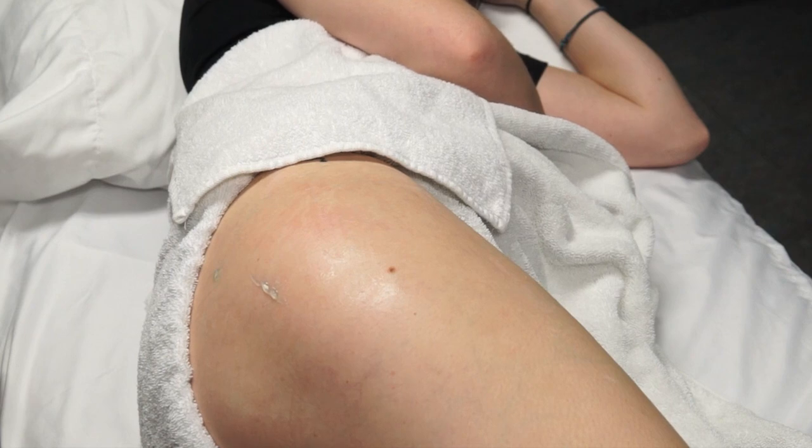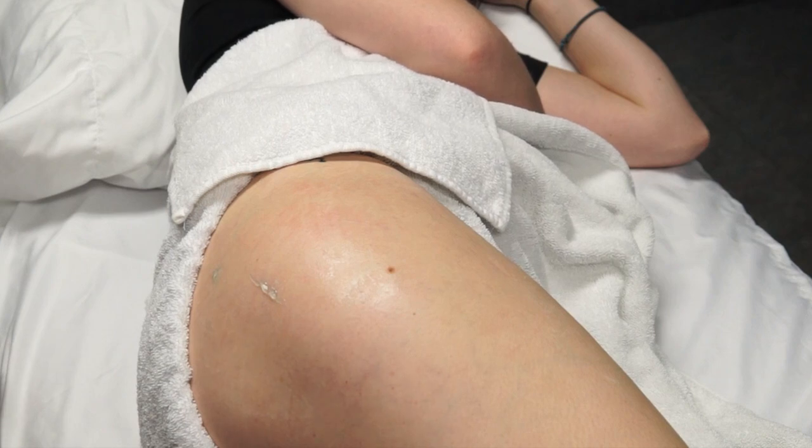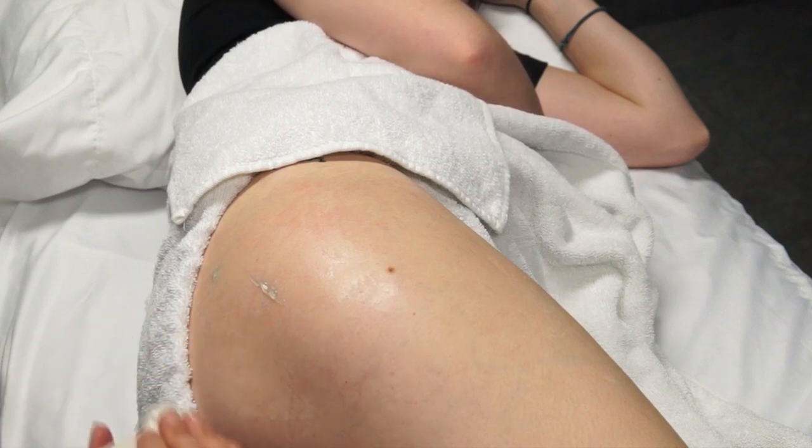Okay, now in examining the lateral hip, we have the patient lie with the opposite side down, so that the trochanteric region, which we're examining, is now up. You can use a linear transducer for this. It's a more superficial structure.